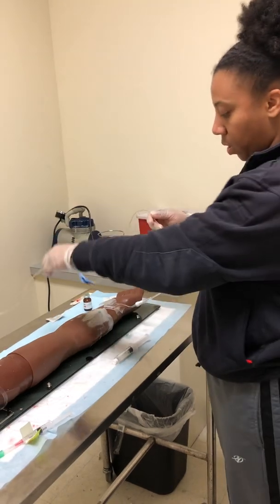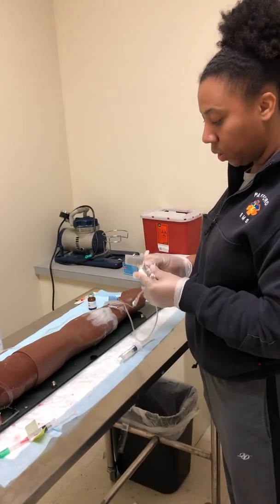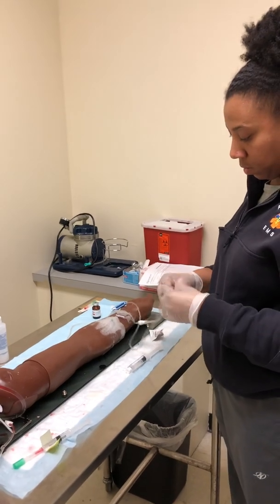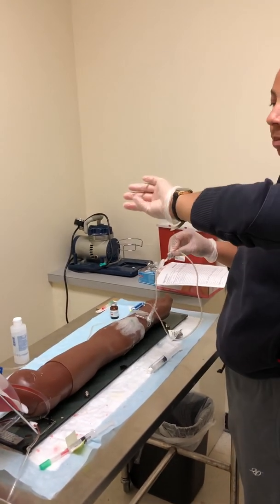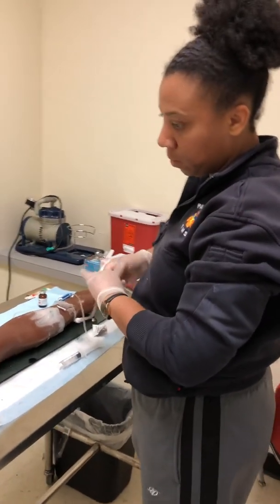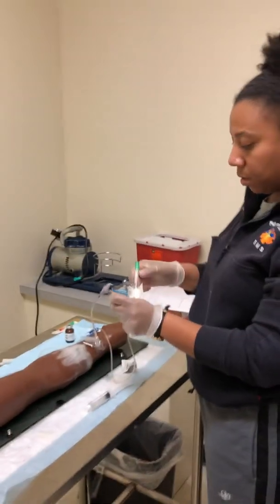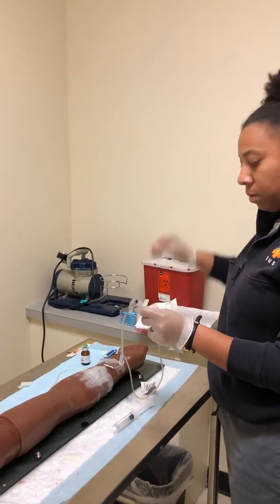I'm going to actually use the port that is closest to the patient here, but before I use that, I'm going to clean the hub. Make sure the fluid is on. I'm going to clean this for 15 seconds. Okay. Get my medication. I'm going to take this part off. Dispose of it. Okay.